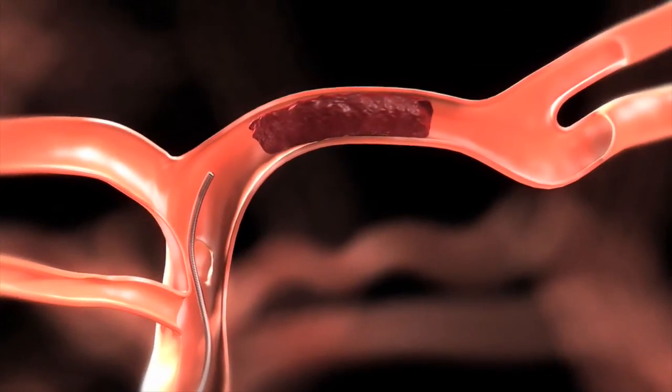We catheterize the arteries inside the brain, the carotid artery, and then into the middle cerebral artery. You can see the clot within the middle cerebral artery, which supplies blood to that half of the brain.